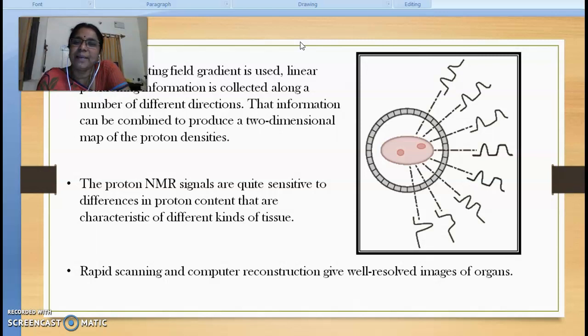So finally I can tell you that whenever a patient is seated on the MRI structure and sent inside the MRI scanner, it is going to detect from top to bottom by dividing the body into different slices whenever it passes through the particular radio frequency coil and strong magnetic field. So it is going to detect the protons, that is hydrogens, which our body mainly consists of in the form of either water or fat.